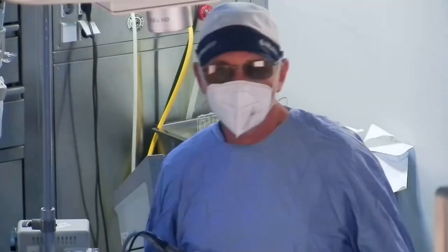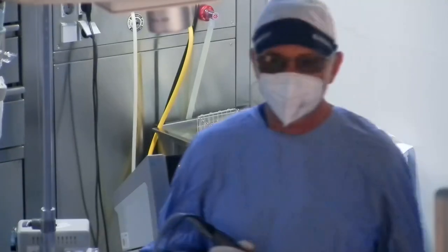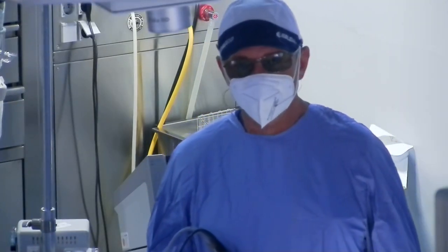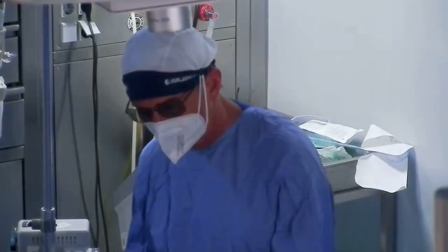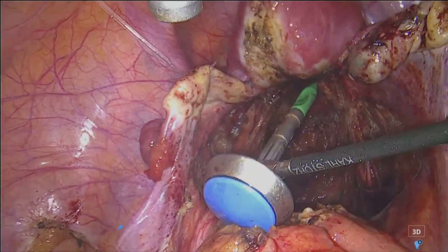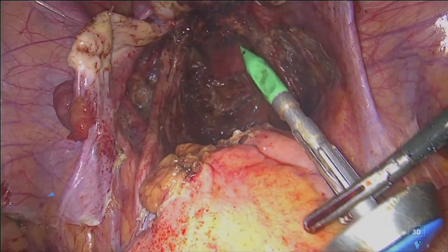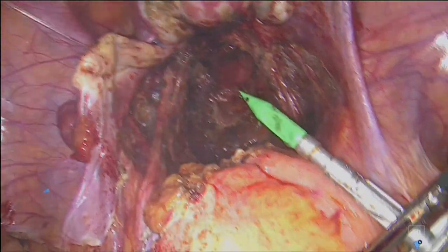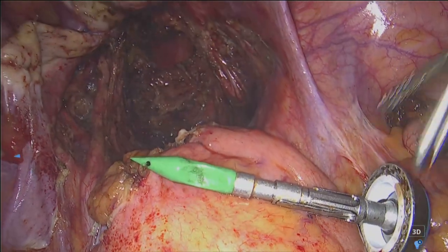Okay, El Sharif asked me to ask if the sonographer has a specific preparation that she recommends before the scanning. She recommends the use of a small enema just the same morning of the examination, and no more. This is enough. Evaluation is only by transvaginal ultrasound.